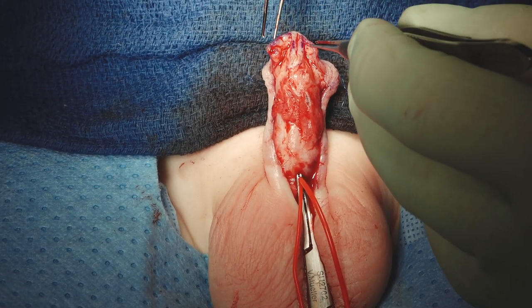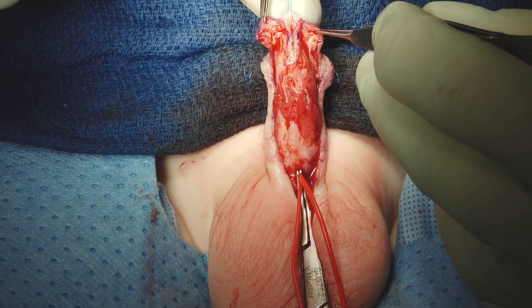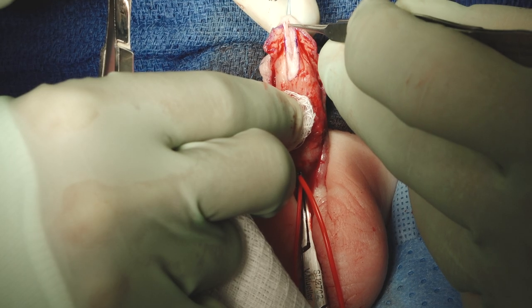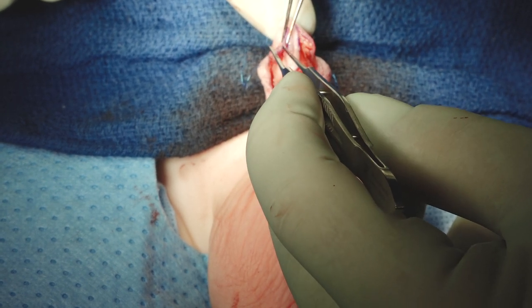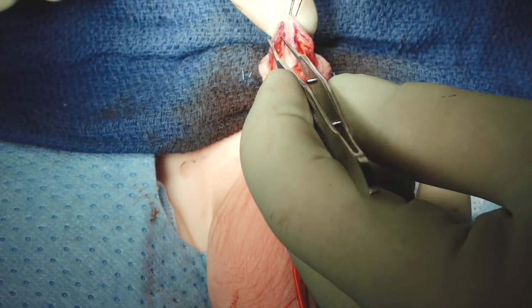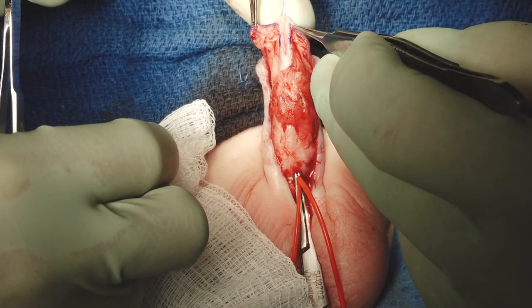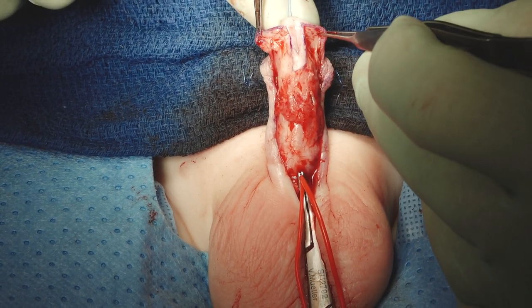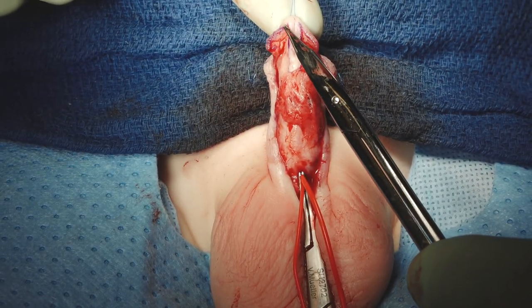An important question: how high do you dissect your glans wings? There are two schools of thought. We go right at or just slightly below the end of the urethral plate. Some people don't open it this far — they open it just to there and leave this all attached because in their mind that's going to be part of the meatus anyway. This is the landmark — how far you open it. All of this is going to be incised, which sets up the whole operation as we take the glans wings up to that point.